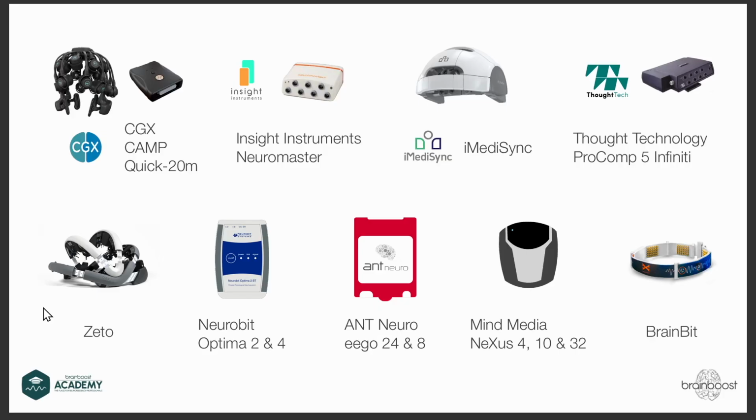The BrainAssistant. As always, we have a lot of different hardware connected to our BrainAssistant. If you know different hardware that you feel like, hey, this might be interesting, feel free to send us a message and we will try to also contact them.